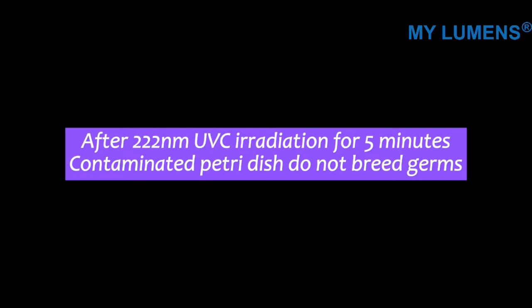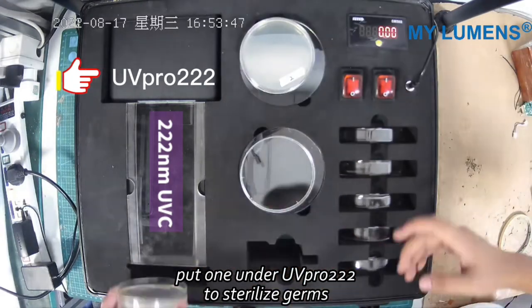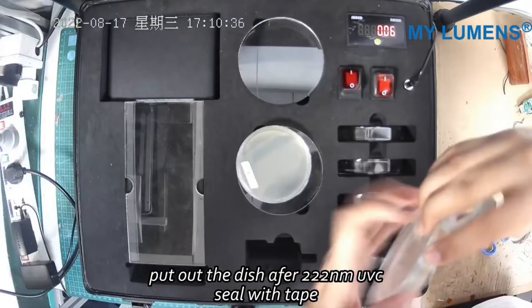After 222 nanometers UV-C irradiation for 5 minutes, a contaminated petri dish does not break germs. Touching petri dishes with uncleaned fingers, put one on the UV Pro 222nm to sterilize germs. 5 minutes later, remove the dish after 222 nanometers UV-C treatment and seal with tape.